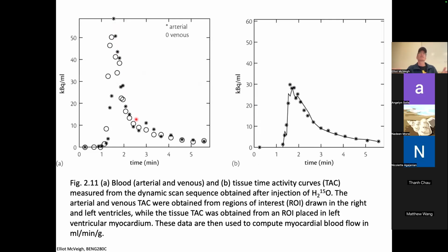So it was like, what is the response of my system? If I put a delta function in, I get what the system is actually doing to the signal. Exactly the same thing, this is in time, but we've looked at this in terms of point spread function in space. We put a dot, image the dot, we get a blurry thing. The blurry thing is what the system did to that dot. The equivalent dot in time is bang, a delta function that has huge contrast, then goes away, and we see what does the system do to that signal.